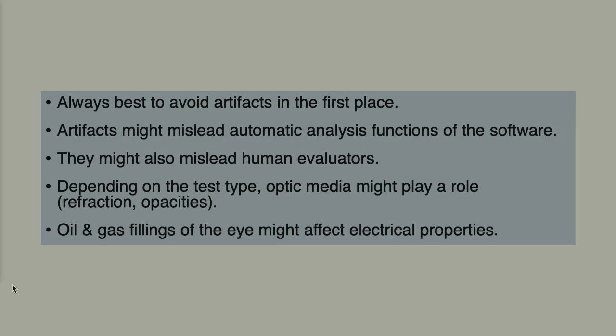If a cataract gives you a lot of stray light, then basically the flash that's coming from one stimulus patch produces stray light that scatters all over the retina. So the response that you get is then not fully localized anymore from that one patch, but rather the stray light stimulates the full retina, so you get partly something like a faint Ganzfeld response. And that's, of course, something that the analysis software doesn't know. So it might give you responses that are not so perfectly localized, even though it shows them as localized responses.